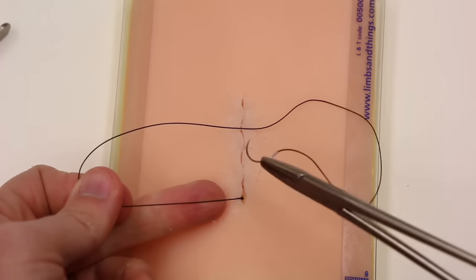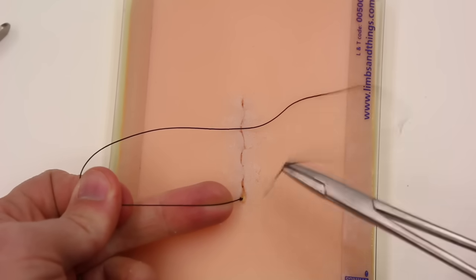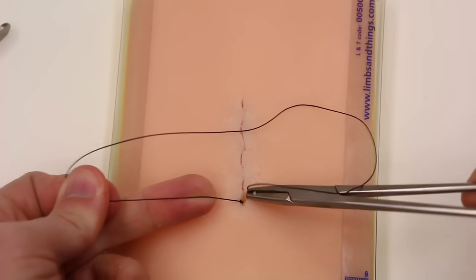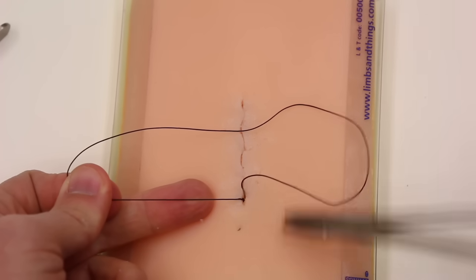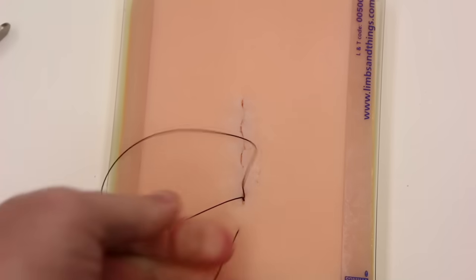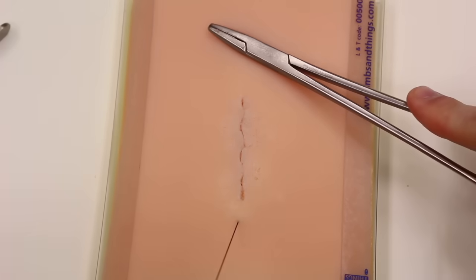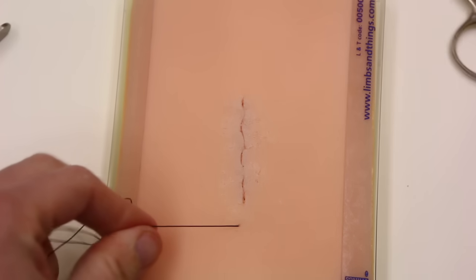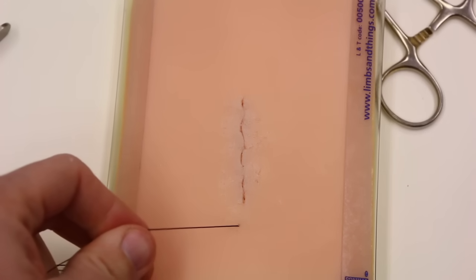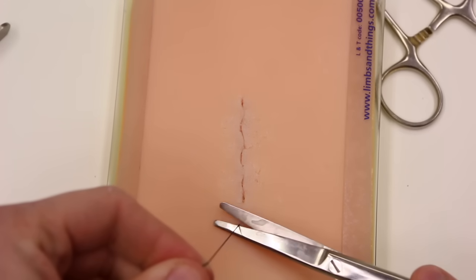Now that you have your knot tied, reload your needle one more time. Pull up on the suture end, diving down, coming out anywhere on the skin. Grabbing the needle, pulling through, then just cut the suture flush with the skin.